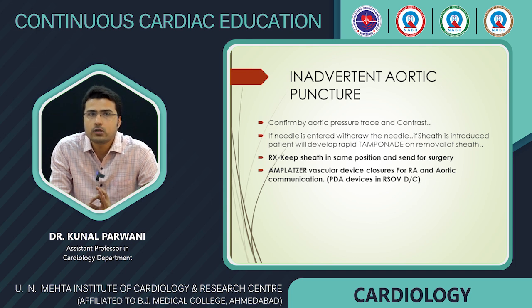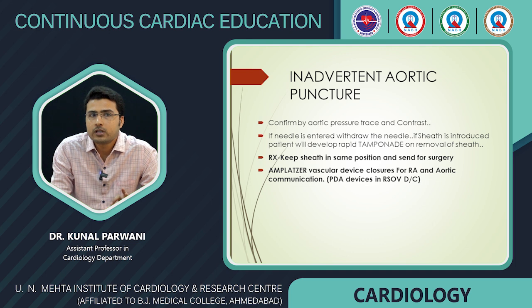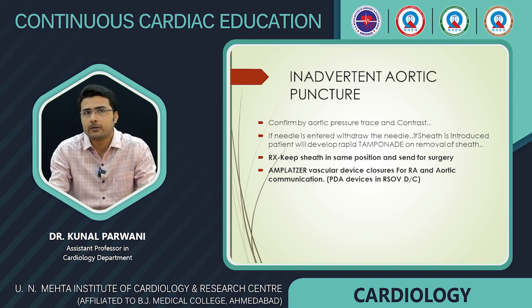If the sheath is introduced, then the patient will develop rapid tamponade on removal of the sheath. In those cases, you don't have to remove the sheath. Keep the sheath in the same position and send for surgery. Sometimes intravascular device closures are used to close the perforation.